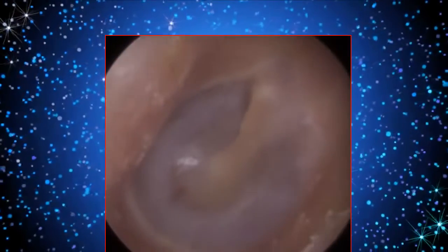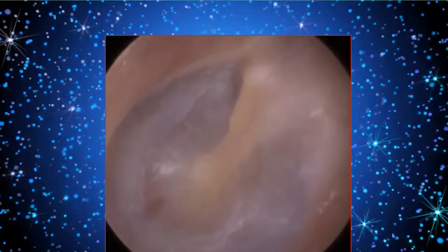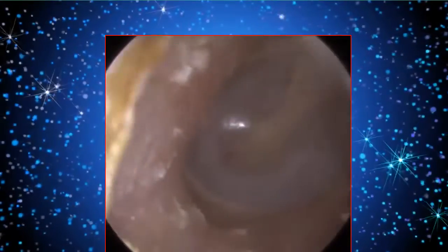So 60% of earwax is actually dead skin. In this patient, I would say it's a bit of a higher concentration, around 70%. And that makes the wax a bit dry. And you can see this wax was really dry. It was lodged all the way deep. You can see around the edge on the lateral canal wall, there's some dry skin here.